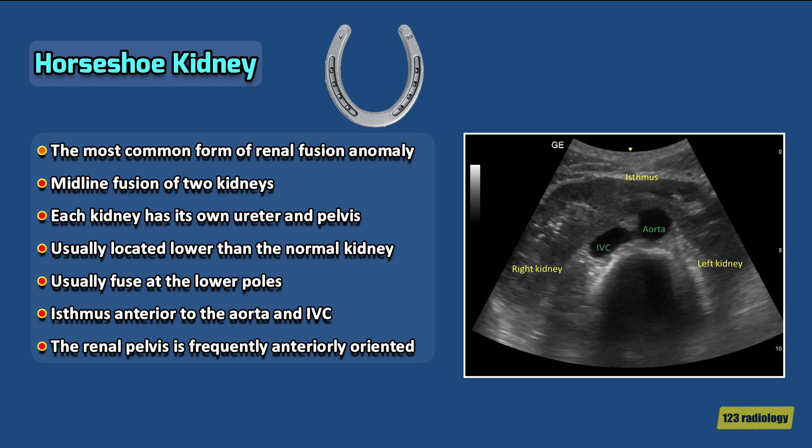Horseshoe kidney is usually ectopic and located in a lower position than the normal kidney. The two kidneys are fused through the lower poles by a connecting band of renal tissue called an isthmus. The isthmus is usually situated anterior to the aorta and inferior vena cava.